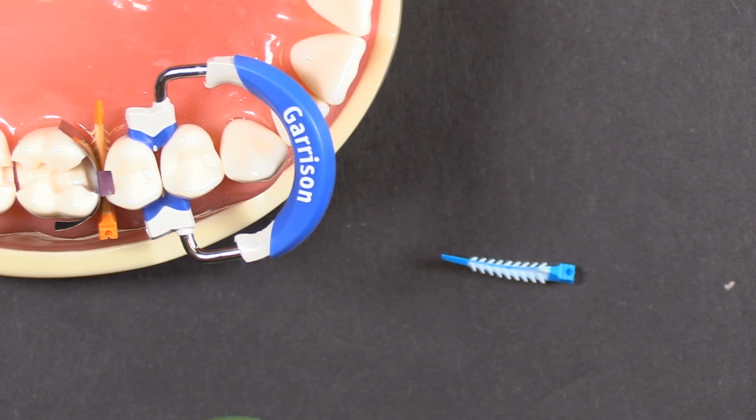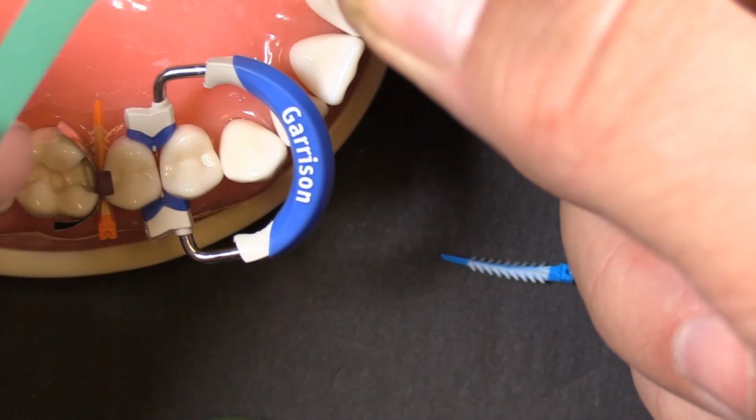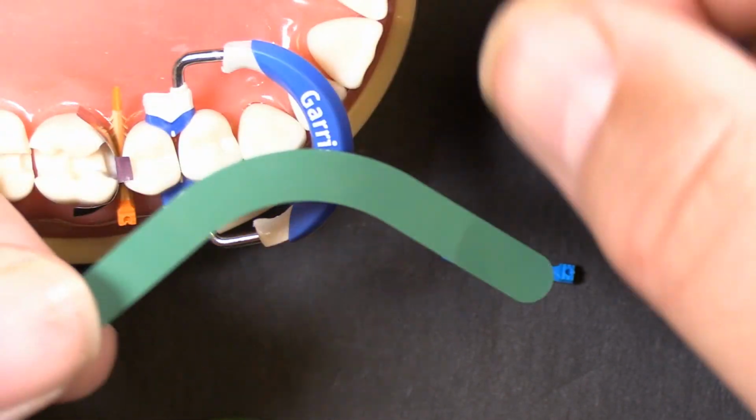If it's farther than that, first of all, you're creating a circumstance where you're going to have a food trap underneath there by trying to extend that so far. A way to help with one that is really wide, if you're not going to go to a crown and correct it that way, is this basic Tofflemire band.